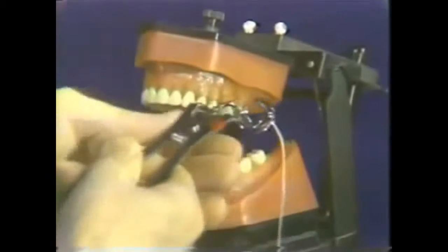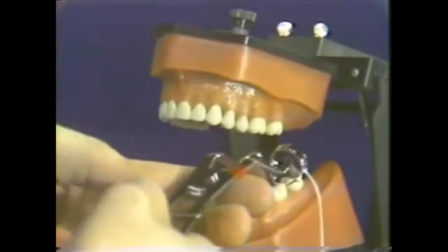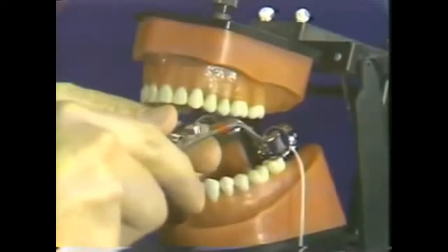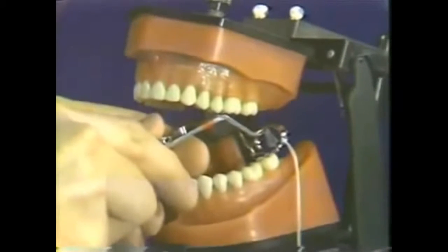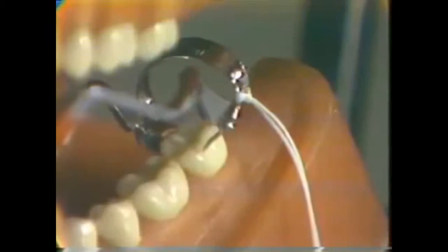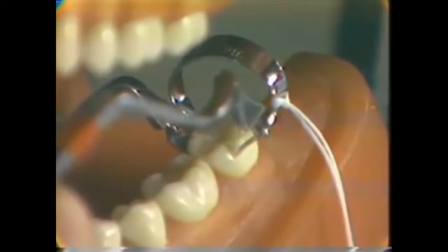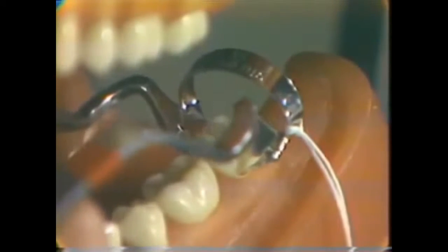Now, bringing back the rubber dam clamp, first the clamp will be placed and then the rubber dam will be placed. The clamp again is placed so that the jaw will engage the molar tooth first on the lingual aspect. Notice that it's being dropped toward the lingual, tipped upward on the buccal, because it's possible to look carefully only at one or other of the surfaces. So it will be placed first to the lingual and then tipped over toward the buccal.